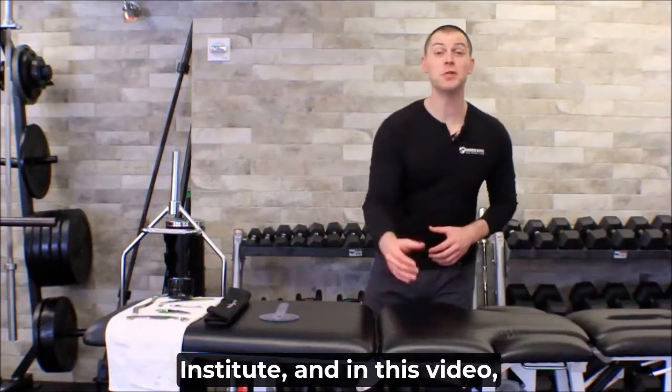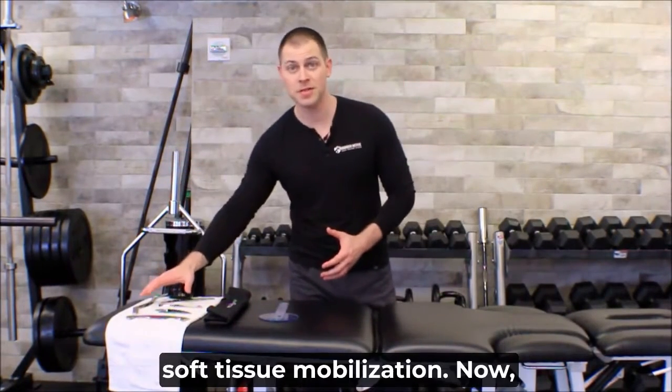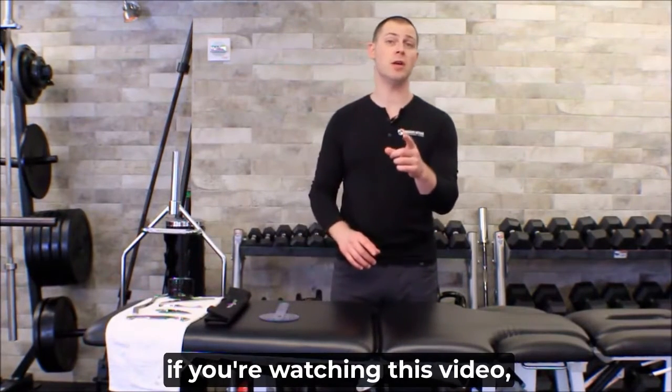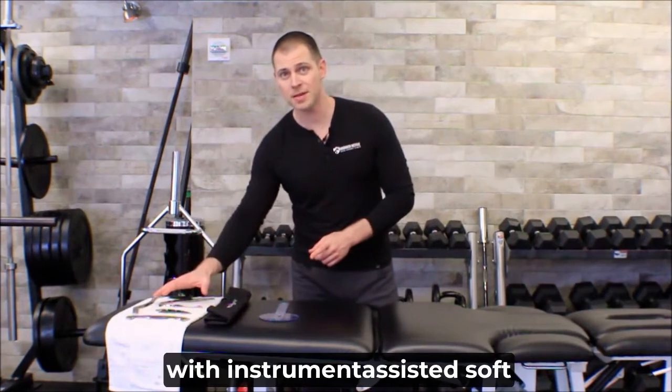This is Brent of the Brookbush Institute, and in this video we're going over manual therapy techniques, specifically instrument-assisted soft tissue mobilization. Now, if you're watching this video, I'm assuming that you are a licensed medical professional with instrument-assisted soft tissue mobilization within your scope of practice.